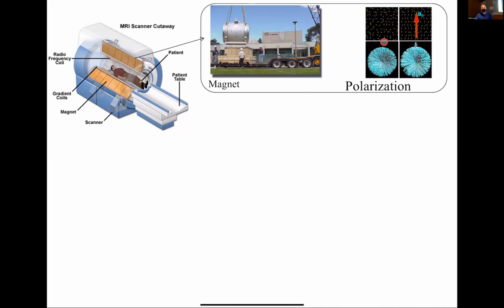The other thing we talked about that's important, and we'll revisit this in a minute, is precession. The other thing that spins do, in the presence of an external magnetic field, is tend to precess around that magnetic field. The precession aspect turns out to be super important for almost all aspects of MRI. We'll see it in excitation, we'll see it in encoding. So you'll want to get a good handle on what precession looks like, and we'll have lots of examples of that.